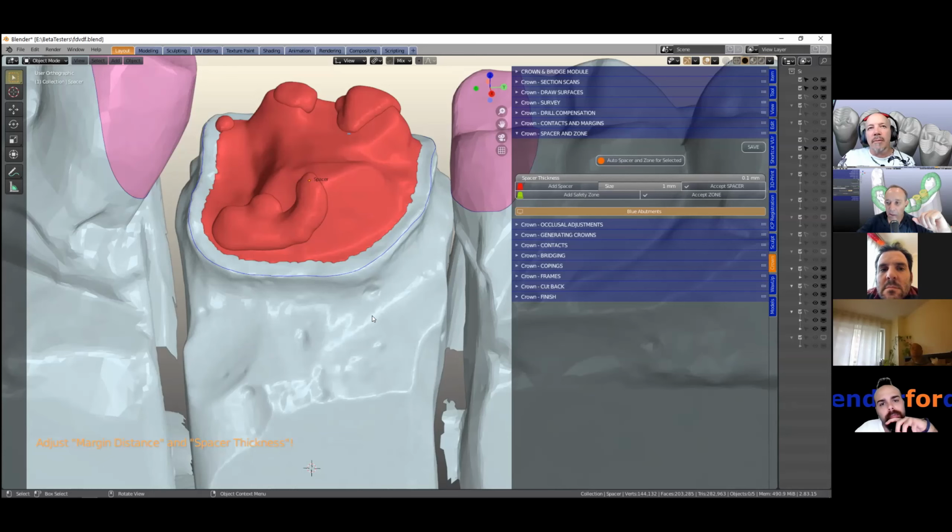Well, that's zero, because that goes onto the surface. But Wolfgang, the zirconia crowns that we've done in the past, we've never had a problem with that at all. I am talking about the experience I had on Exocad: by designing on Exocad, depending on which material I will use, I need more or less gap. Maybe when we do that call, I can show you what I mean.